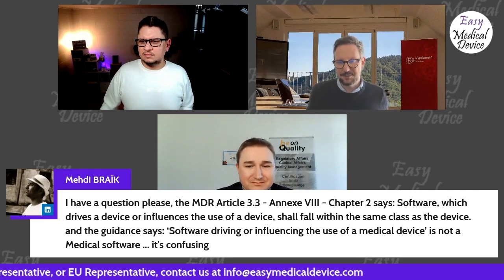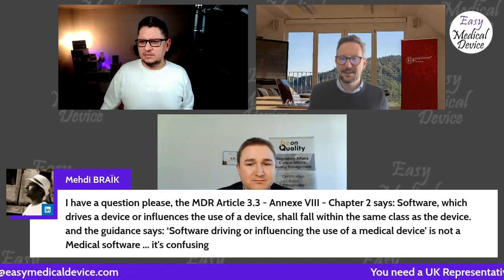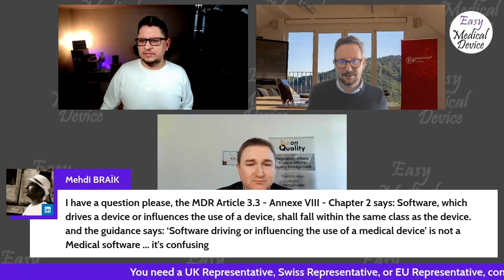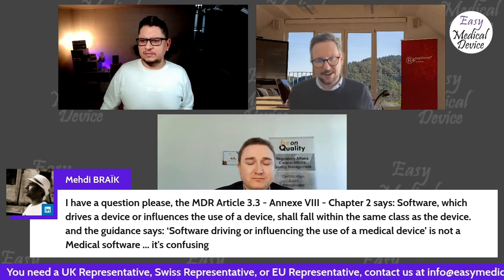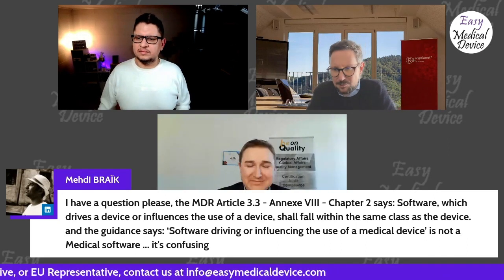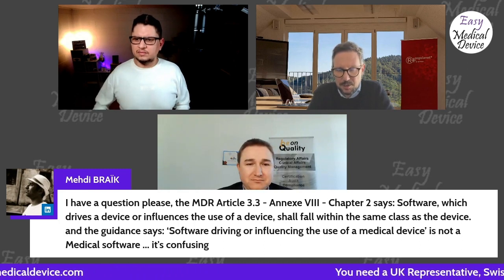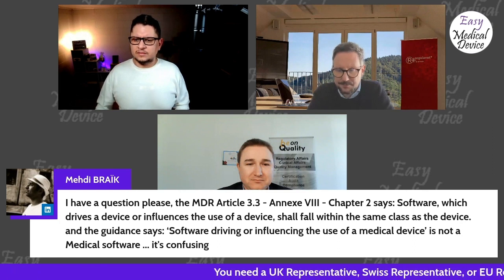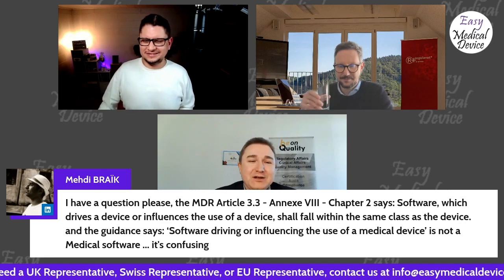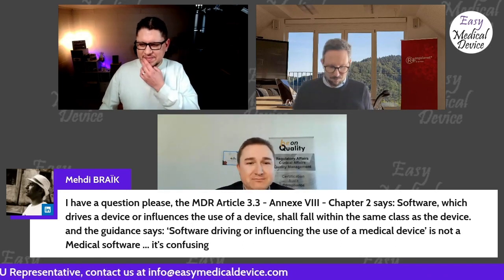And indeed, the other rule from the MDR is just to make sure that if you have a software as a medical device and then you connect it to a different medical device, for example, and you influence it, then you might have the same class unless your software is even higher already. Then you remain in the same class, because of the other implementing rule that says if several classes apply, you stick to the one with the strictest rule, the highest class on your product. Stefan? Yeah, it's nothing to add. It is not very nicely written for those who are not native English speakers.